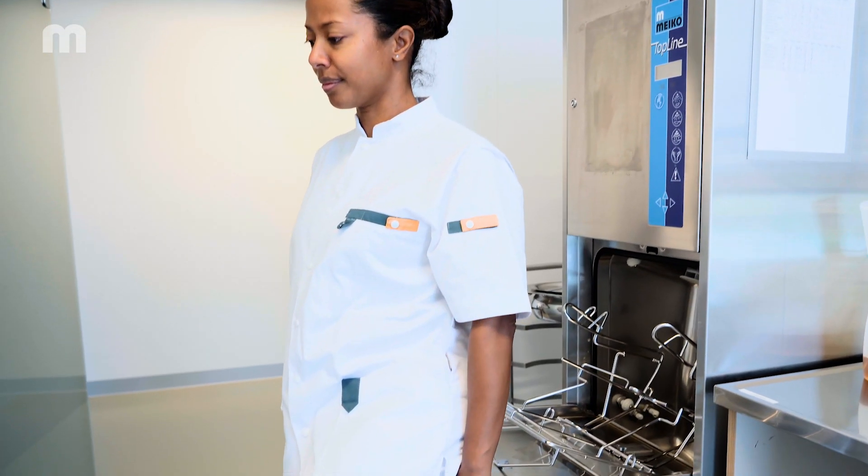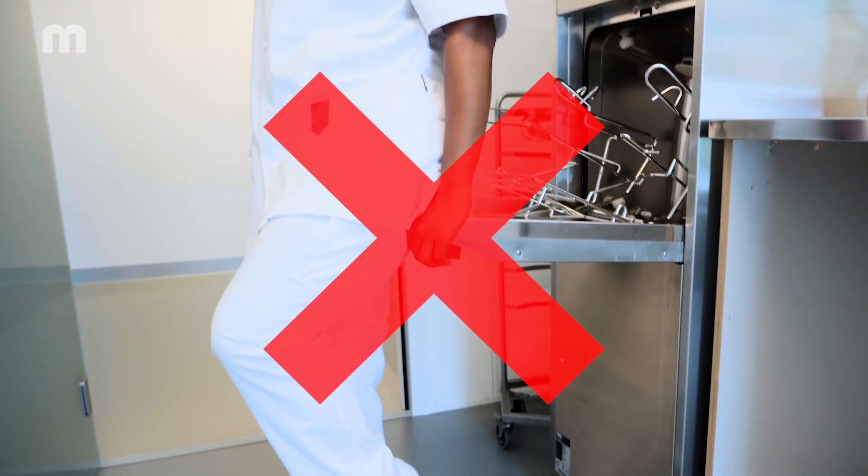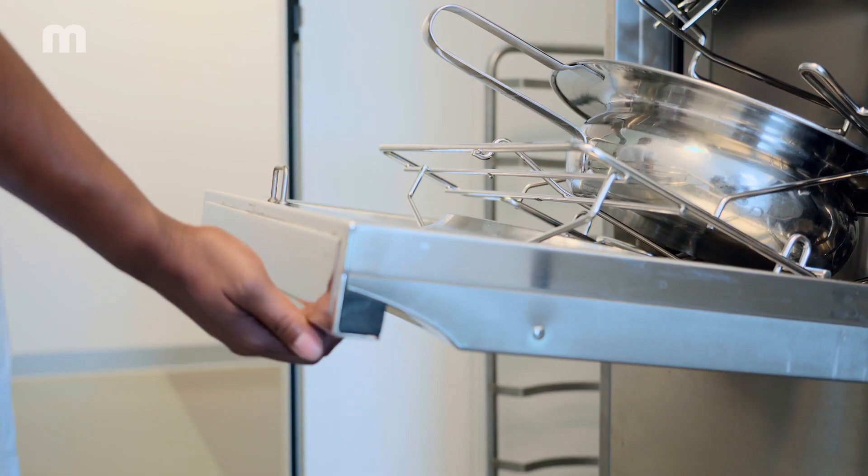The bedpan washer disinfector is not a chair. Please do not lean on it or sit on the lowered door. Never close the automatic door manually.